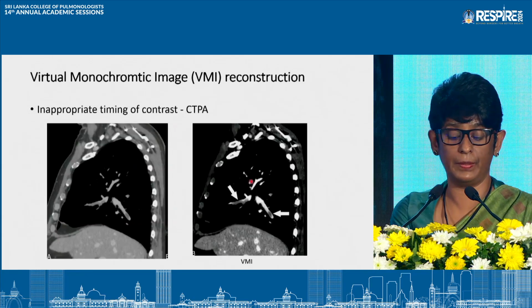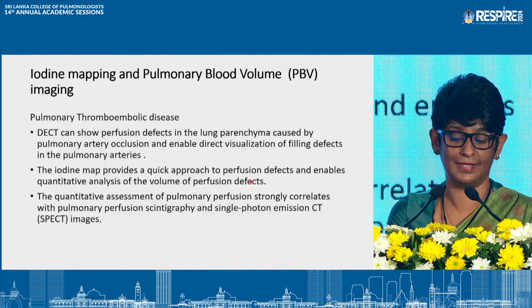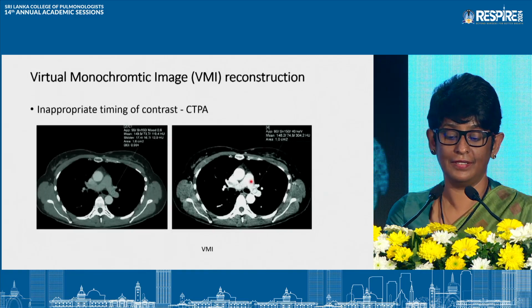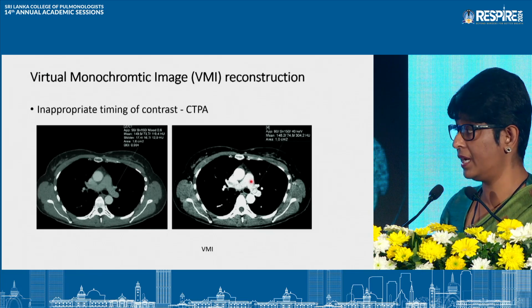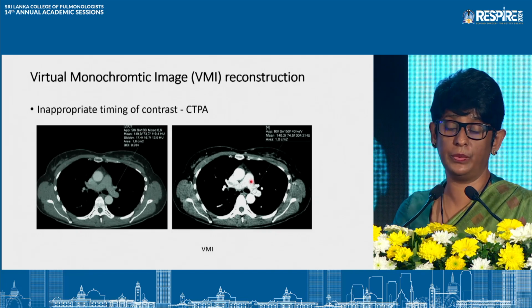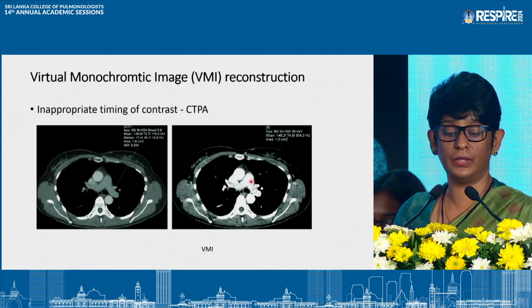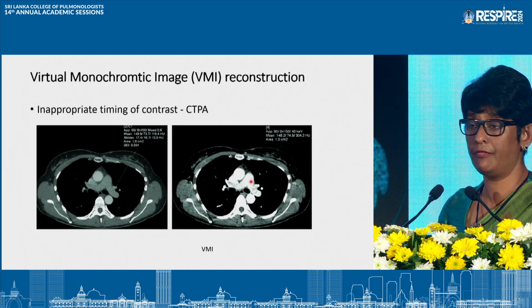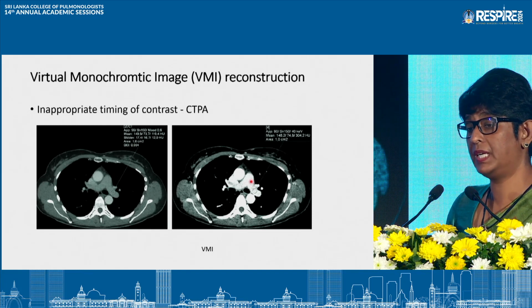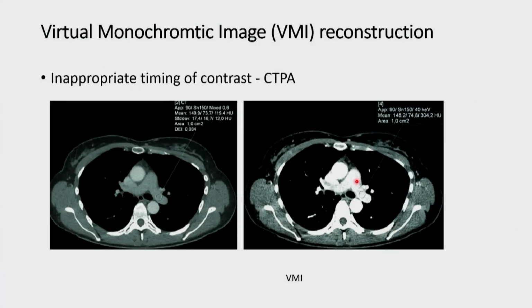Okay, the second set of images shows the reconstructed main pulmonary artery with an HU value of 304. Now, we have not given additional contrast, but using the application, we have optimized the already available iodine attenuation within the pulmonary vessel to develop diagnostic images.